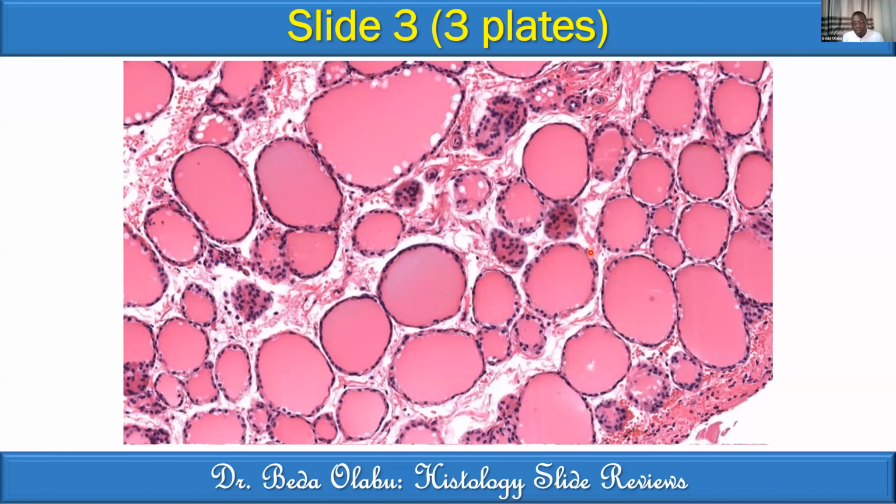We are able to confirm the shape of the cells which surround the homogeneous material, and Mercy has correctly picked that. Most of them are actually simple squamous here. I agree with you, Mercy, on that one. Most of them are simple squamous, like in that zone, although some of them are cuboidal, like this one. So the homogeneous materials are surrounded by either simple squamous or simple cuboidal epithelium.